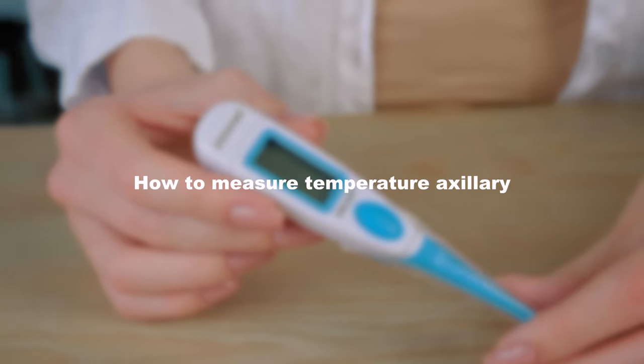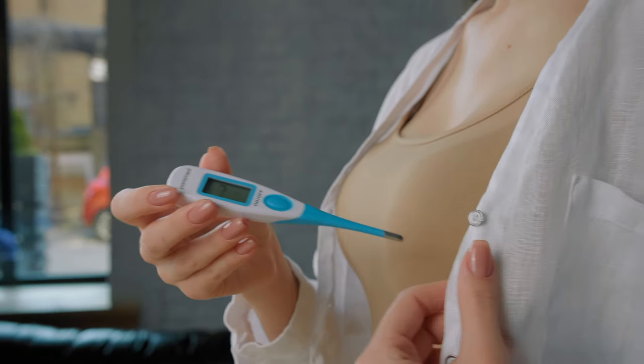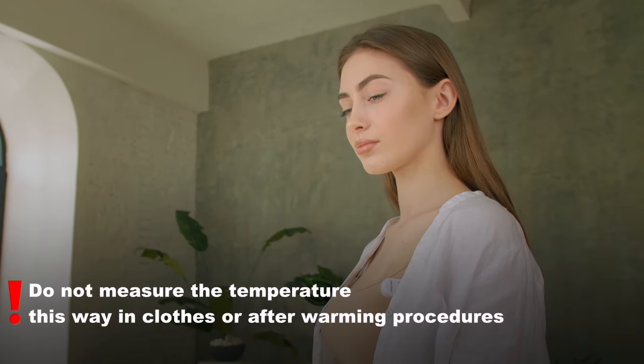How to measure temperature axillary. This is the easiest measuring method. You need to switch on the thermometer, place it under your armpit and wait for results. During axillary measurement, we advise you to keep the thermometer in place for another minute after the signal in order to allow the device to average the results.